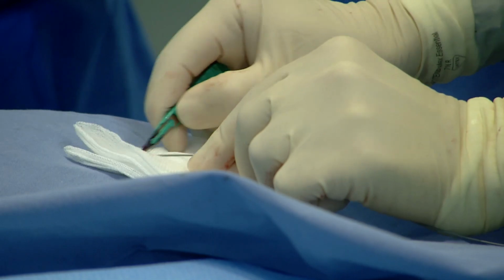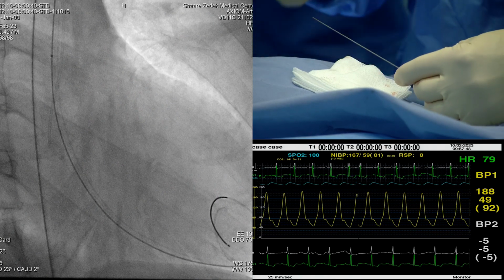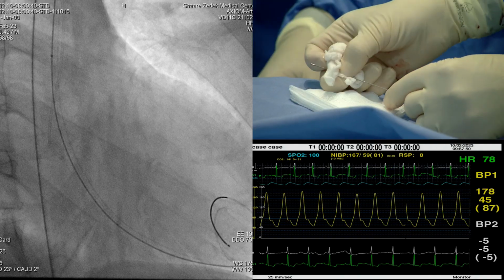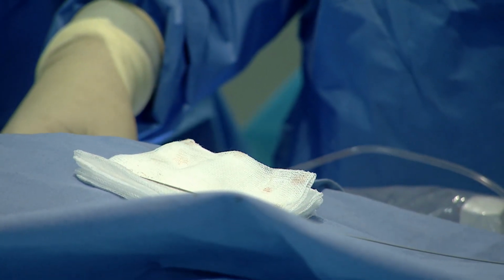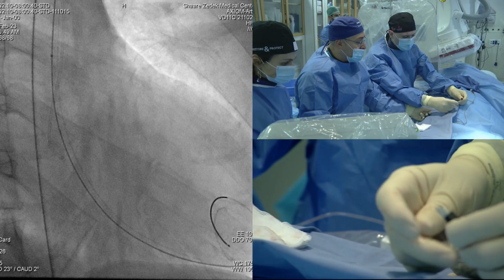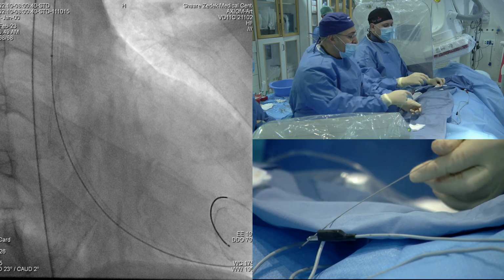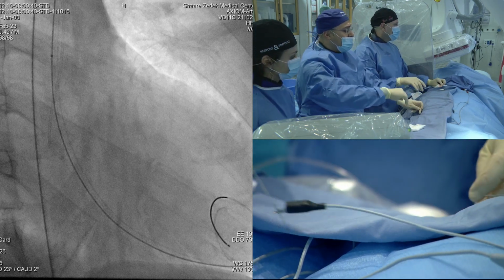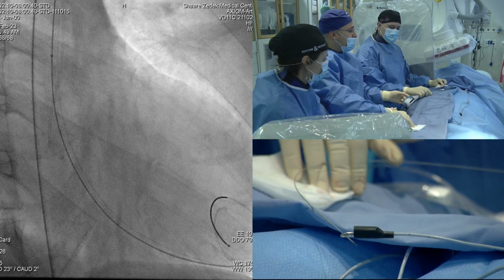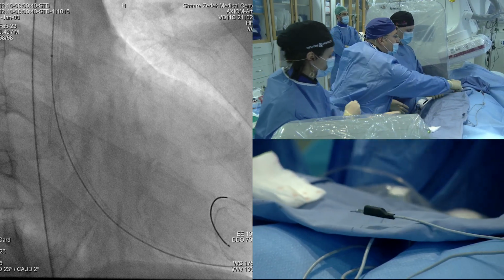Yes, we don't see it here on the screen, but when we look at it a bit above, the annulus is closer to 80 than the conventional was 84.5, and below it was 80.5, something like that. So it was a bit smaller. So it also pushed us to do it with a smaller option between the two.